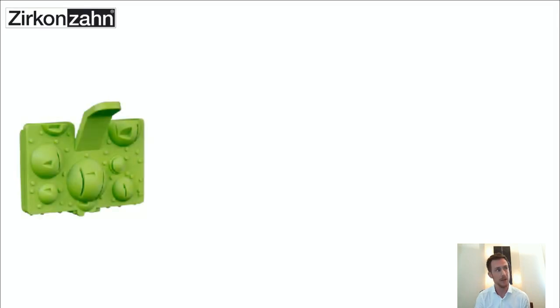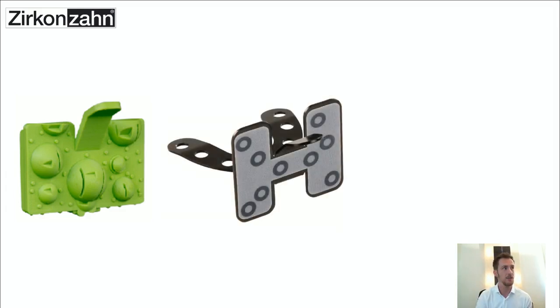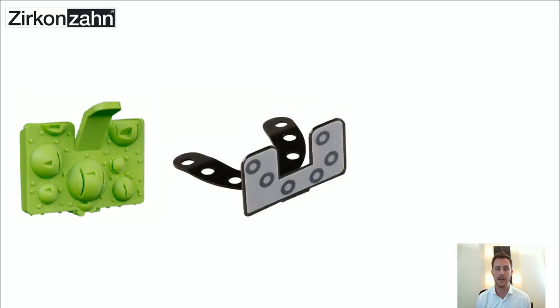But a lot of people say, well, this is not a whole digital workflow because I still need the fork as a physical object to rescan it to match everything later on in position. Hold on. We have a solution for that to complete the whole digital circle, because we have this kind of cover. And this cover allows me to slide it onto the fork, but not anymore onto this fork. We have now, and you can just buy now, this small fork, this shorter fork, where you can slide or put the cover onto it.